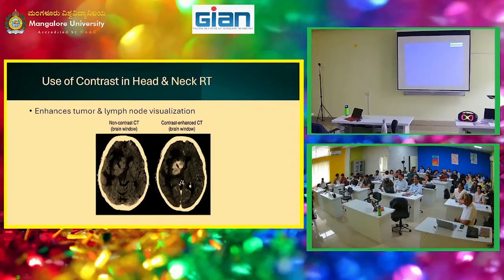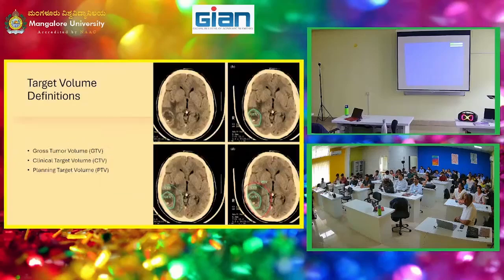And so there's just a very basic way. And so I'm showing you guys because that's what you're working on, right? So that's your target. Okay. So then once you've done that, you're going to then come into the problem that we talked about this morning, and that is segmentation. So Ernest gave a lovely talk about it. And so in this case, the application of what he was talking about is exactly this. Your gross tumor volume is here. So that's the exact tumor, which is what Ernest showed. So that's what he was working on, the segmentation of the actual tumor.